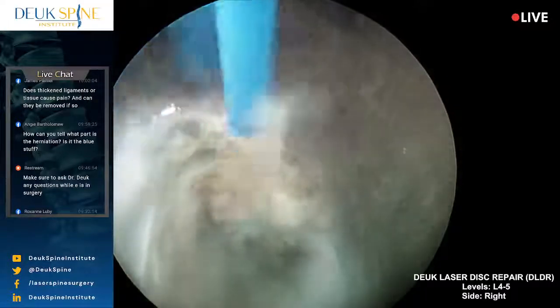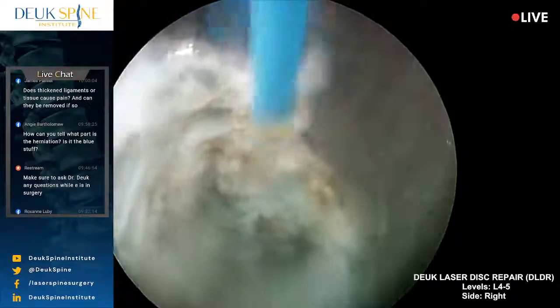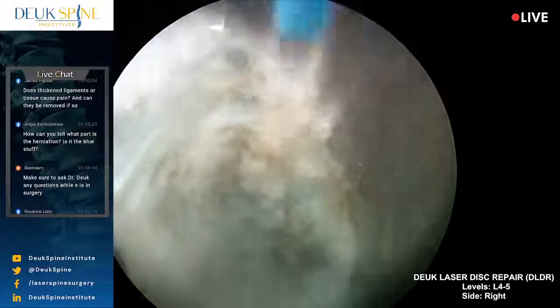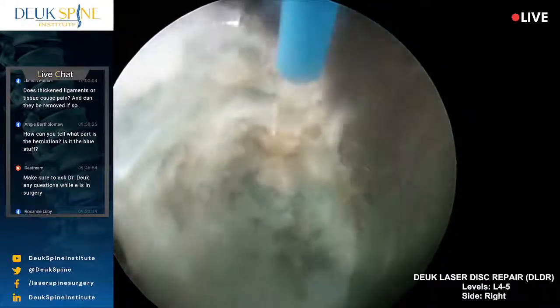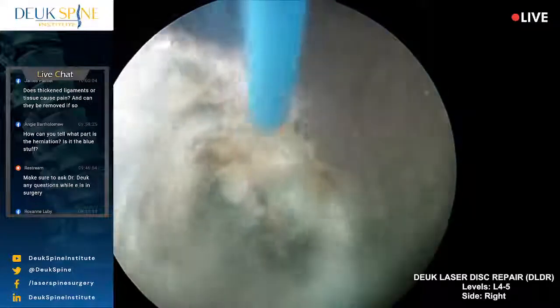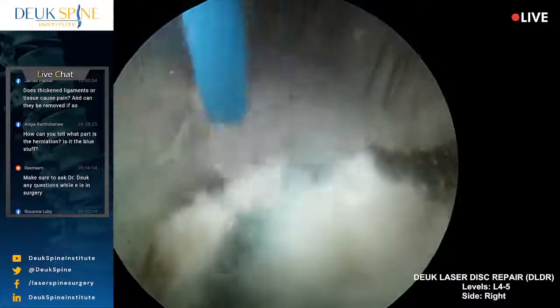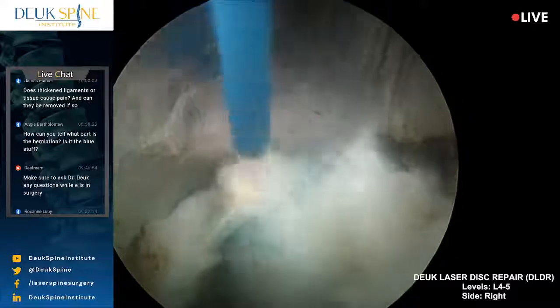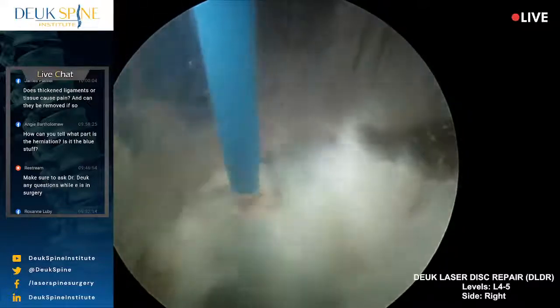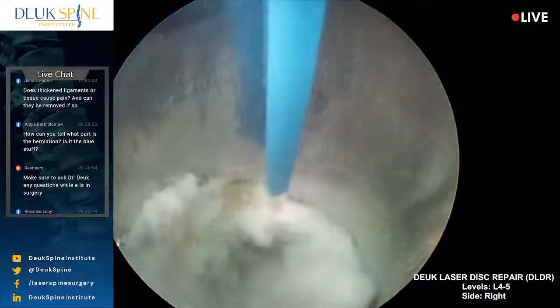Now, there's always more scar tissue as you get closer to the end of the surgery because I'm getting closer to where the blood supply of the disc is, which is the outer annulus, the outer half of the annulus. And as I get closer to those outer annular fibers, I get more blood supply, I get more scar tissue. That's the tear right there as well, laterally. And again, I'm debriding the tear with the laser. That's herniation right there, the blue stuff. See how it's stuck in the tear? That's what's causing all the pain and inflammation.